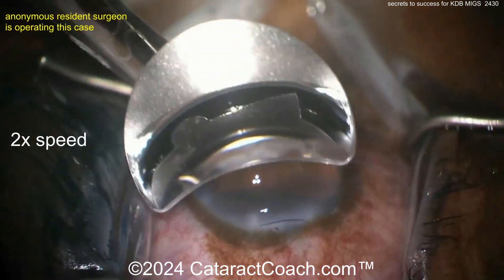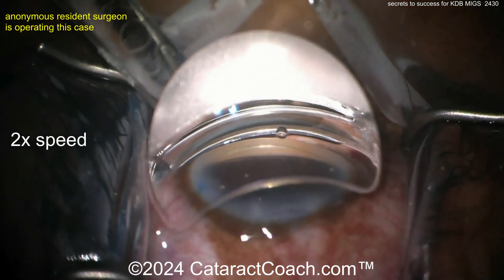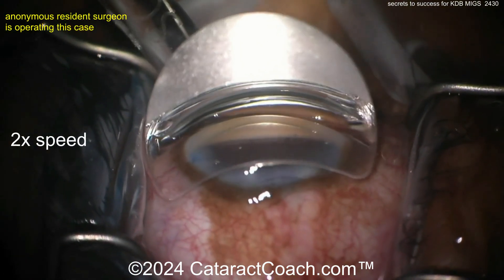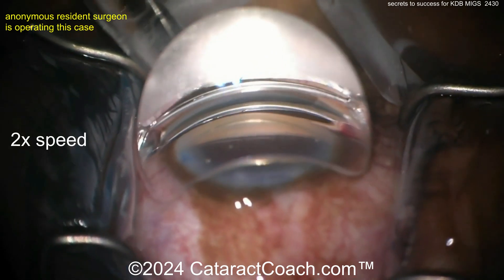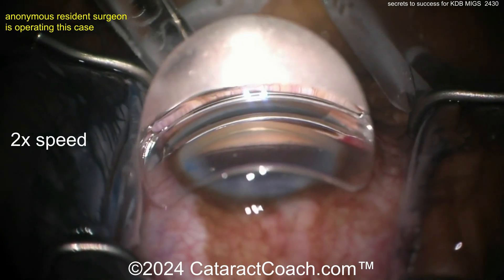The patient's head is tilted away from you and the microscope is tilted towards you. Place the gonio prism on the eye and adjust the patient wherever needed to get a good view of that angle. Look at that — you can see the angle already. Beautiful.